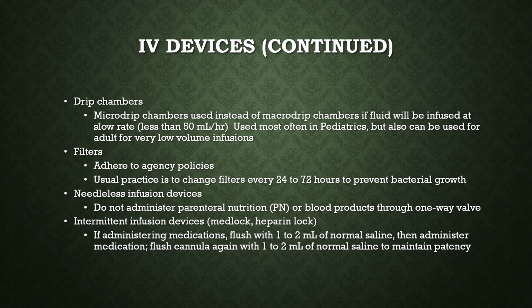And as we talked about earlier, if you are administering medications, you always flush before to assess patency. You don't want to start putting medication into a line that you don't even know is patent, because if it's infiltrated or not working, you start trying to push the med in, and the patient's not going to get their medication. So you want to flush it first, test it with saline to make sure it's patent, and then afterwards we flush it with saline again to flush it on through the cannula to make sure it's all into the patient's tissue. So flush before, flush after. Initial flush, determine patency. Post flush, flush all the medicine through.